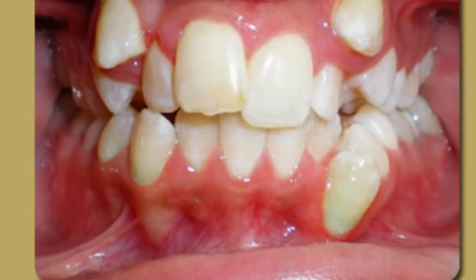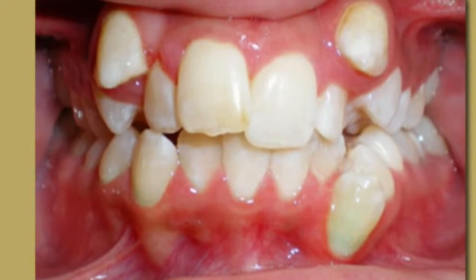Case study: a 13-year-old female presents with crowded teeth in both the maxillary and mandibular areas. Upon clinical evaluation, the dental professional takes a panoramic radiograph to evaluate the malocclusion for eruption patterns, growth, and development.